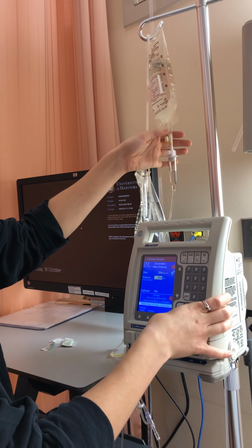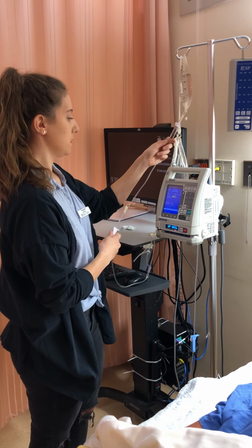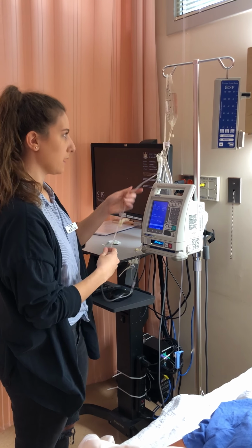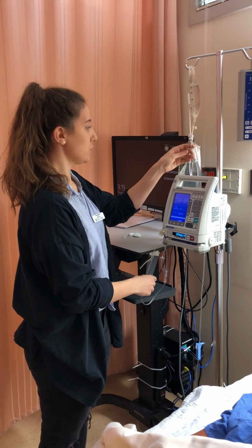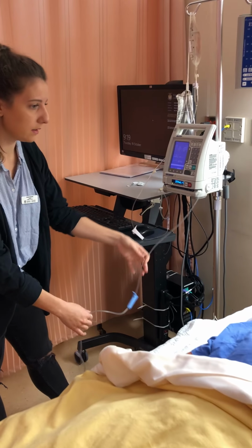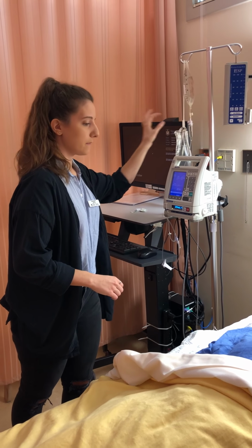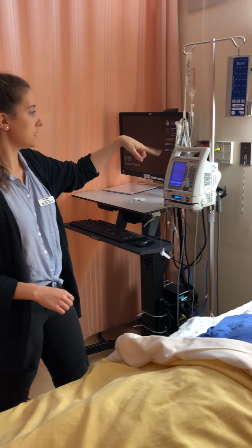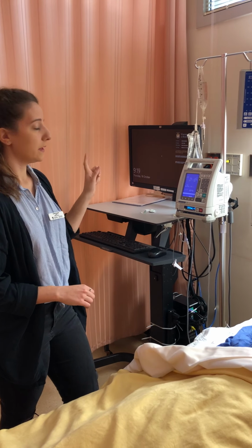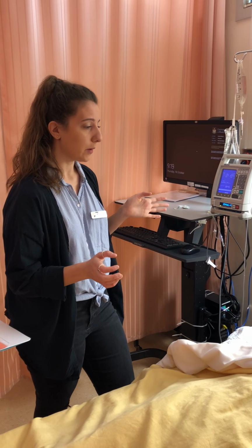Confirming the secondary. I will start it. I will be watching for 3 drops now. Everything is open. This is open. That is good. Okay, so I will be back when this is done in about an hour, to make sure that my primary has kicked back in. I'll let my patient know, so I will be back.